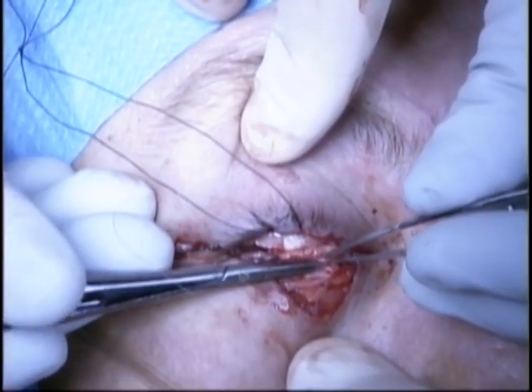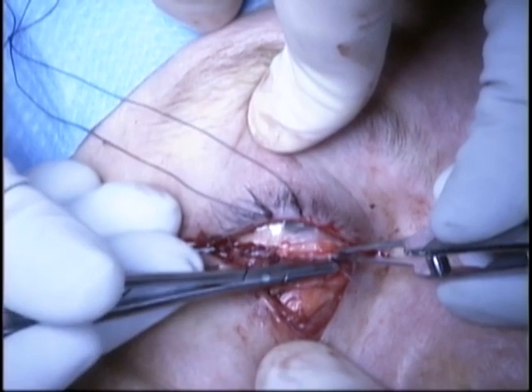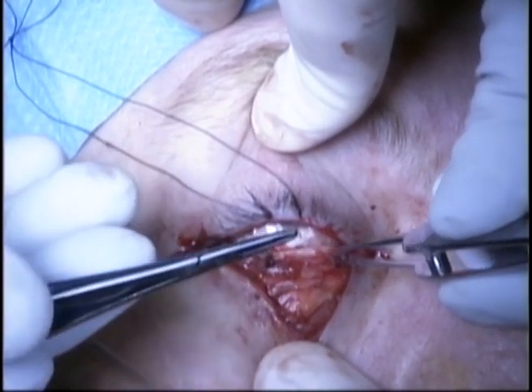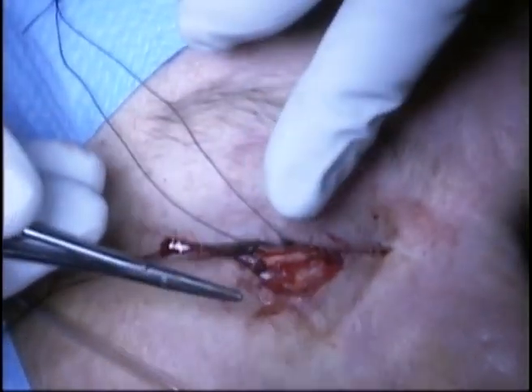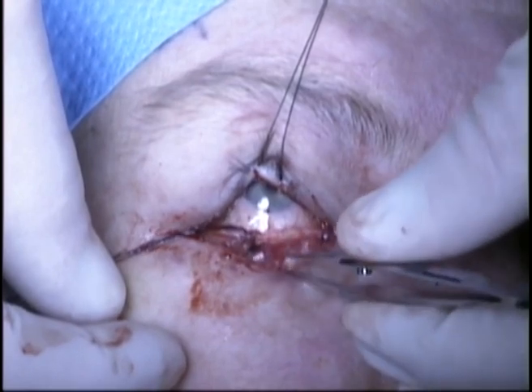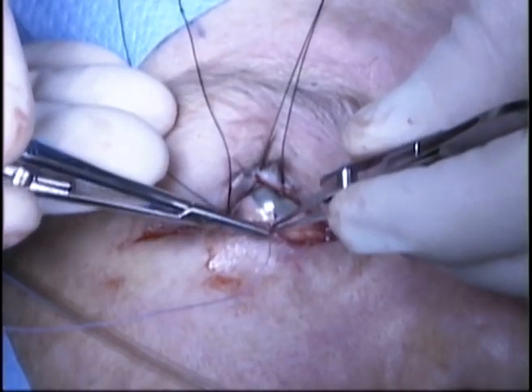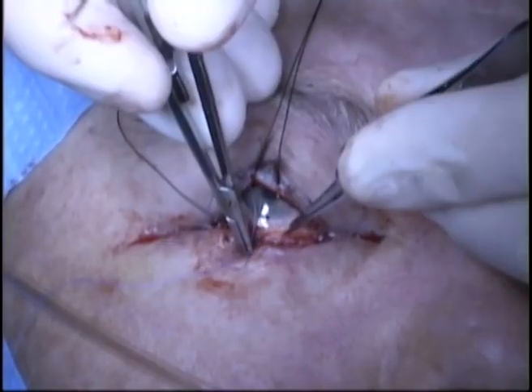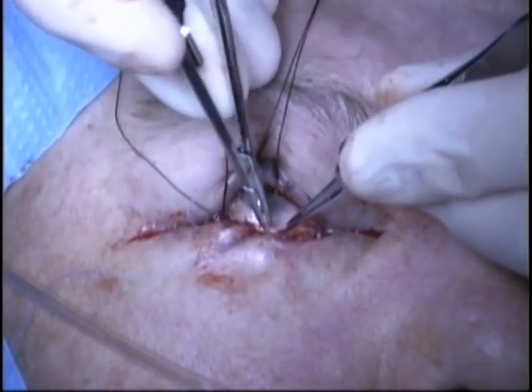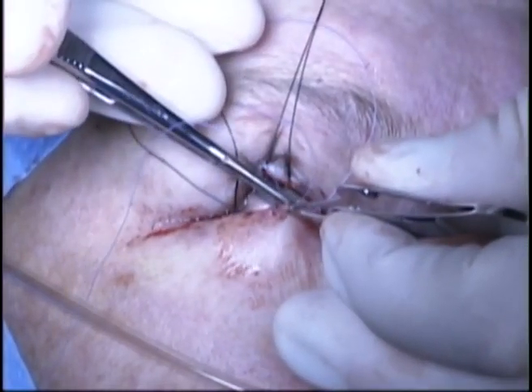This completes repair of the posterior lamellar defect, and the tension of the eyelid appears to be adequate. The anterior lamella is then draped over the posterior lamella. A 5-0 chromic suture is placed through the anterior lamella followed by a partial thickness bite of the anterior surface of the tarsus. The suture is then placed back through the anterior lamella.